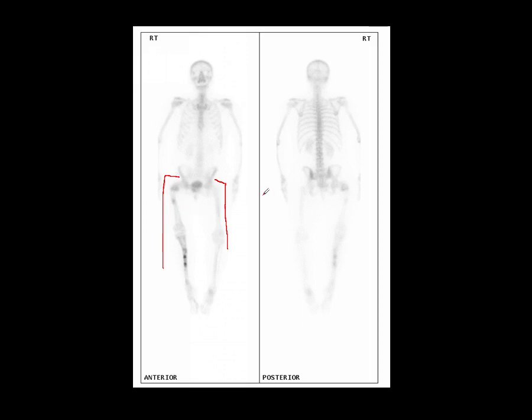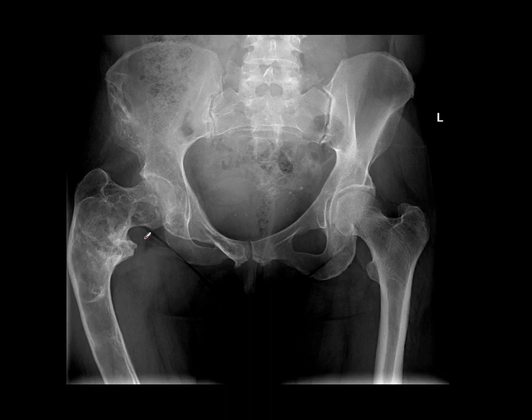There's also a small area of activity in the right pubic bone — you can perhaps see it compared with the left. On the plain x-ray, you can see this underlying ground-glass, disorganised bone textural abnormality within the right proximal femur, and very importantly, a modelling deformity — a change in the underlying shape of the bone. This is a long-standing, slow change; a congenital condition, or one that has evolved very slowly over a prolonged period of time.